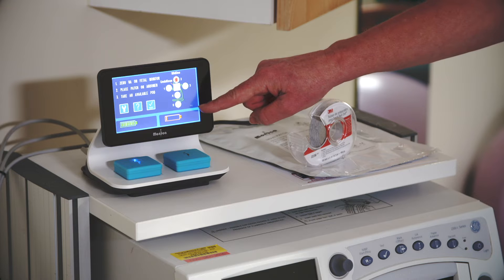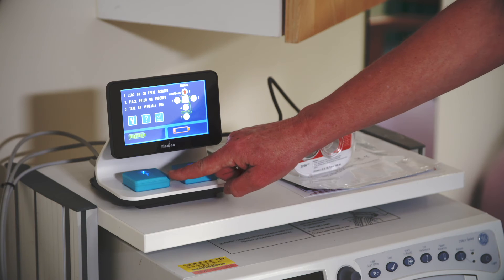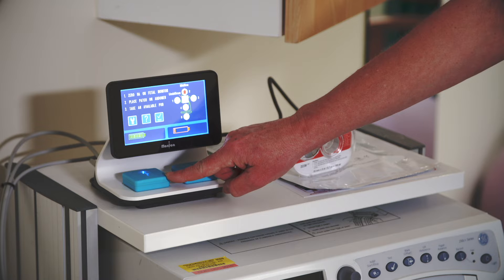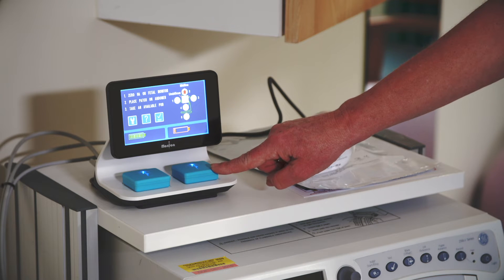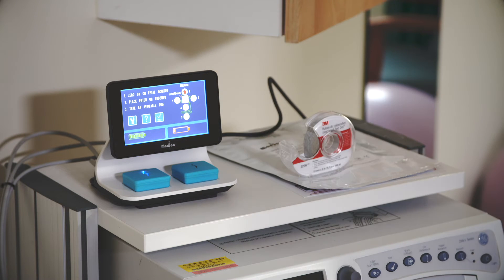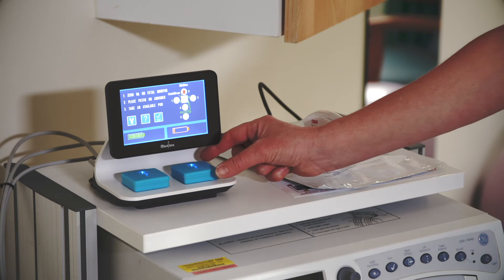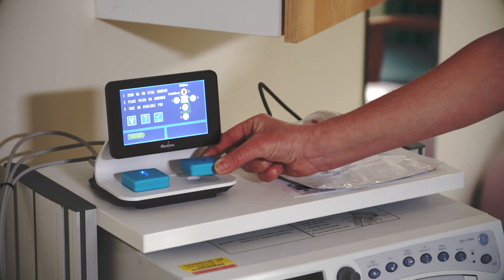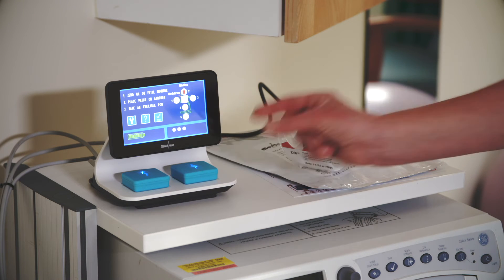But if the battery icon is orange, there will not be enough charge to start a monitoring session. When a pod is fully charged, the blue LED on the pod will be on continuously. And when the pod is charging, the LED will flash slowly. If you remove a pod when the battery icon is orange, it will turn off. The battery icon will disappear from the display and the blue LEDs will turn off. Replace the pod.